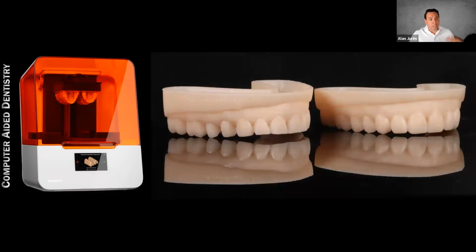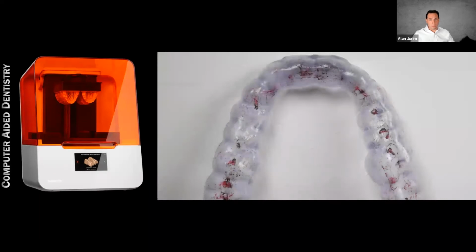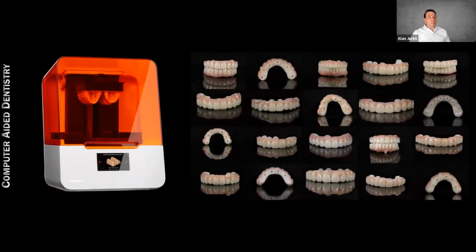So digital dental models, again, very, very important, probably the most common indication that gets used with the printer, surgical guides, and here's what the splints look like. But there's also other indications, and we're not going to discuss them in great detail today: the ability to produce implant models, digital wax-ups, digital dentures, screw-retained implant bridges, try-in bridges, provisional bridges. All of these different indications are really unique in the ability for us to try in restorations and also confirm that the digital information from our design is accurate before we go into a final restoration.